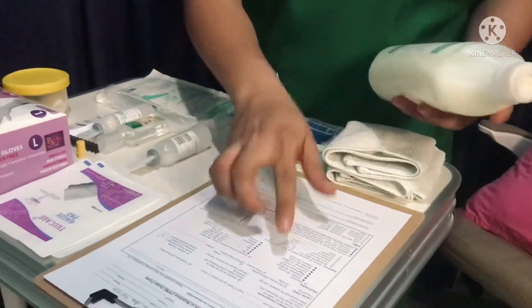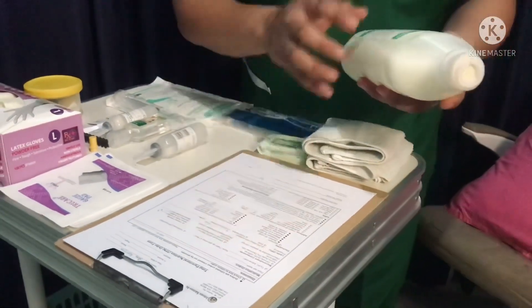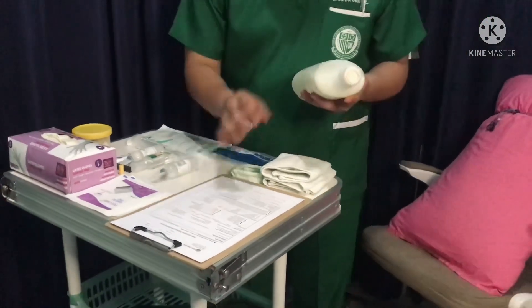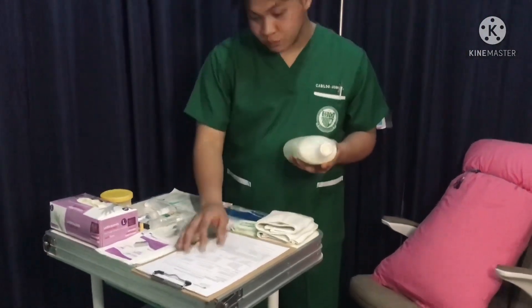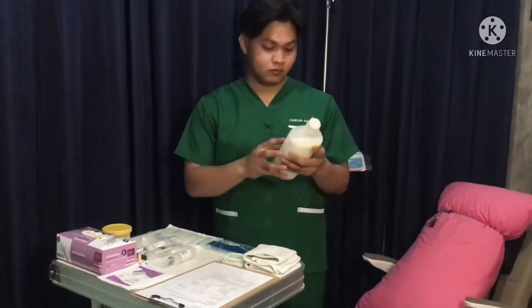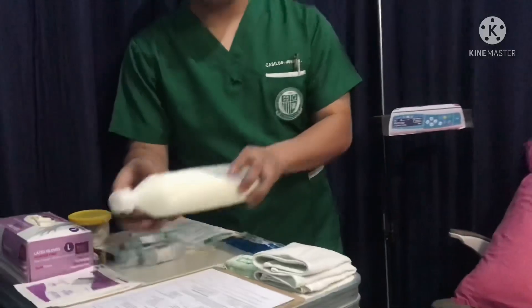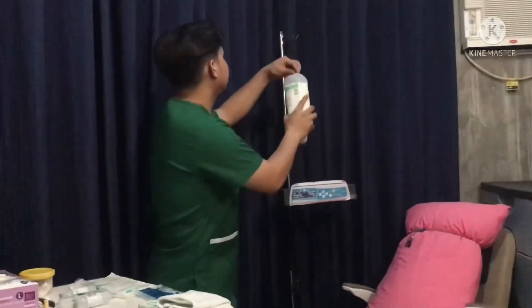Review physician orders and compare to the MAR and content label on the TPN solution bag, including the rate of infusion. Each component of the TPN solution must be verified with the physician's order. Hang the bag of TPN from the drip stand.